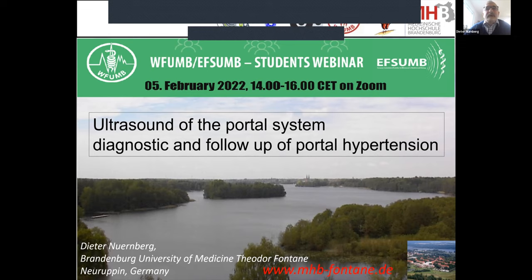Thank you. And I think it's a good idea to discuss also contrast media ultrasound. But Alina, that could be a topic for one of our next webinars, because we need a little bit more time for that. And on the other side, not everywhere contrast media ultrasound is available. That is a problem at the moment, yes. But in Europe, we have a lot of experience now for more than 10 years. And also the thrombosis and the differentiation of the thrombosis, that is one indication in gastroenterology for contrast media ultrasound.